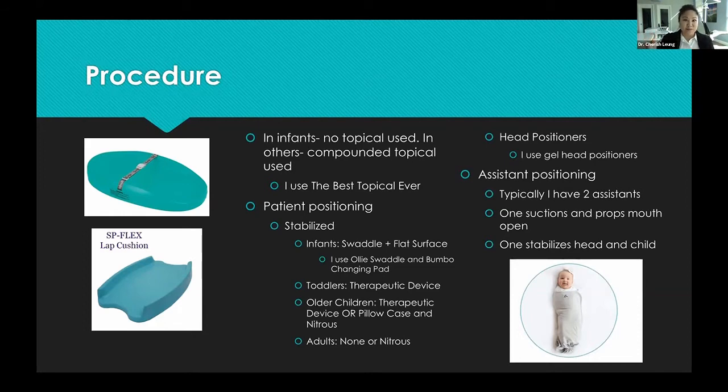So I just have a whole bunch of these ones, and it's 3 Velcros. You just go like this and make sure their arms are down and it Velcros them. And then the bottom has a little elastic tie that you just hold together so they can't get their little feet out.